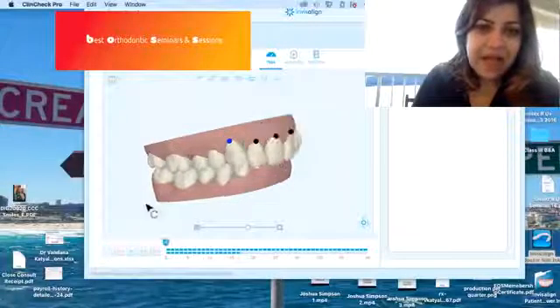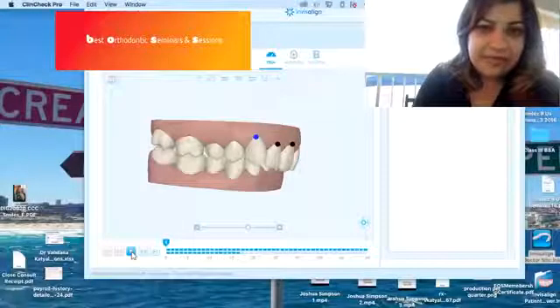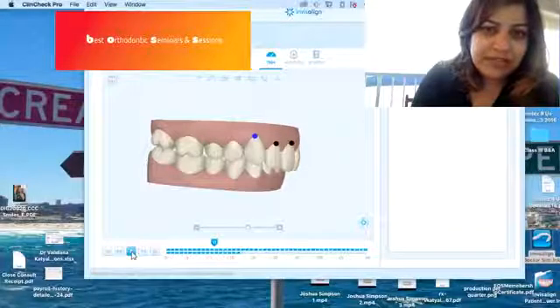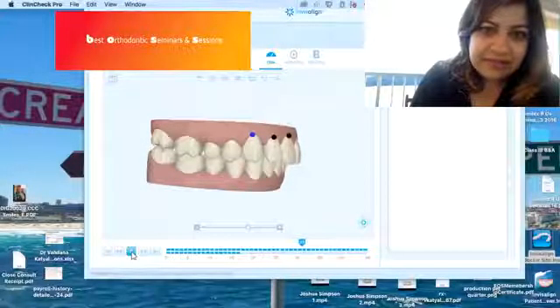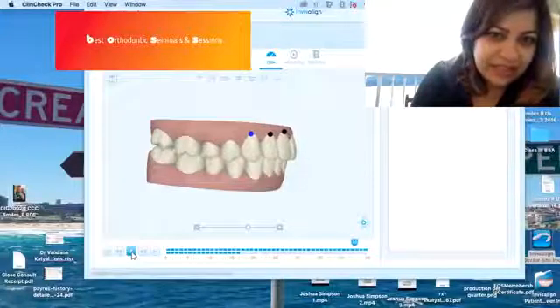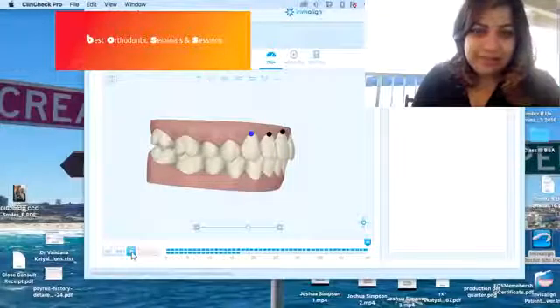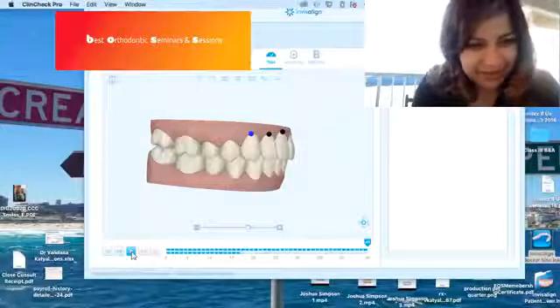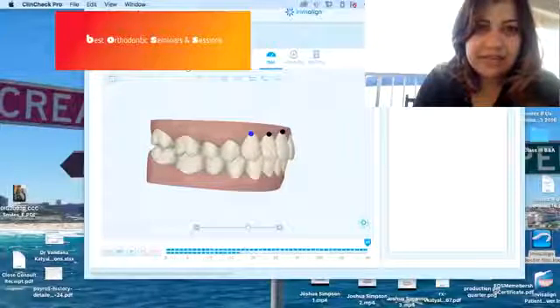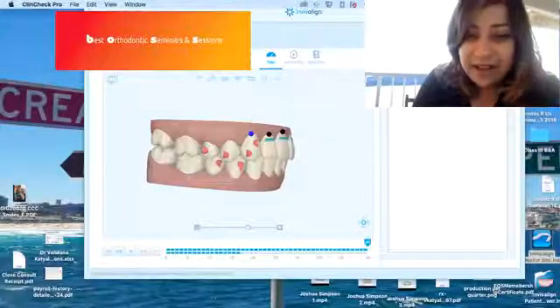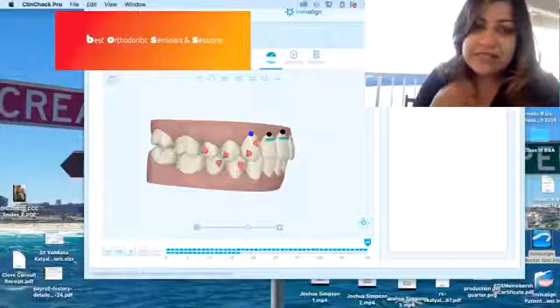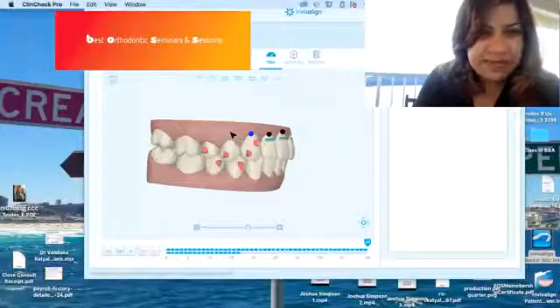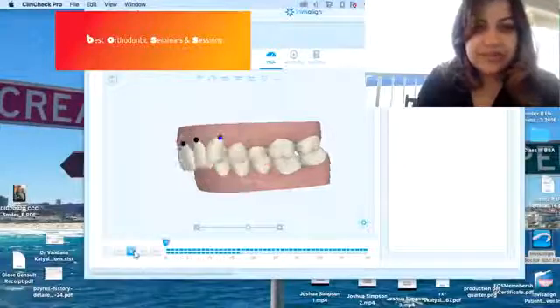What happened? How did they correct the class 2? Let's play the movie. What you're seeing is a bit of proclination of upper and lower incisors. And then there's retraction. And somehow magically, they're retracted. How did this happen? Where did this space come from? Sure enough, if I look at it, and I'm going to show you the attachment, they planned some IPR, which I think is an overkill for this young adult case. And somehow magically, class 1 molar has been created. This side, they've left it as class 2, actually. They didn't correct it.